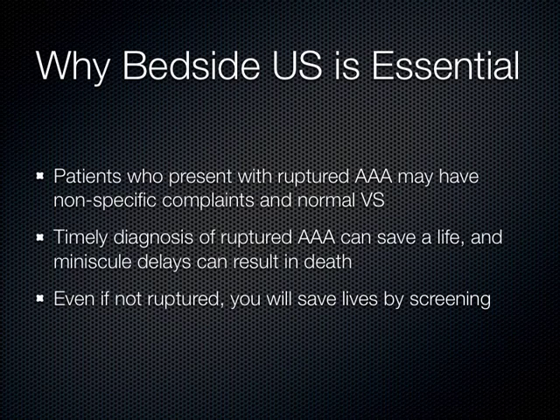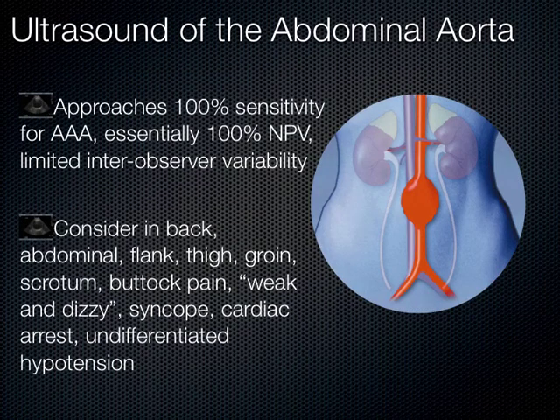So, as you move into next year, when you are doing physical exams with your ultrasound machines, you may uncover this in one of the patients you're seeing somewhere precepting. You never know, okay? Just keep in mind that Medicare reimburses any physician who wants to do a screening bedside ultrasound on any patient greater than age 55. Medicare will give you like $22. So think about that, paying your loans off.